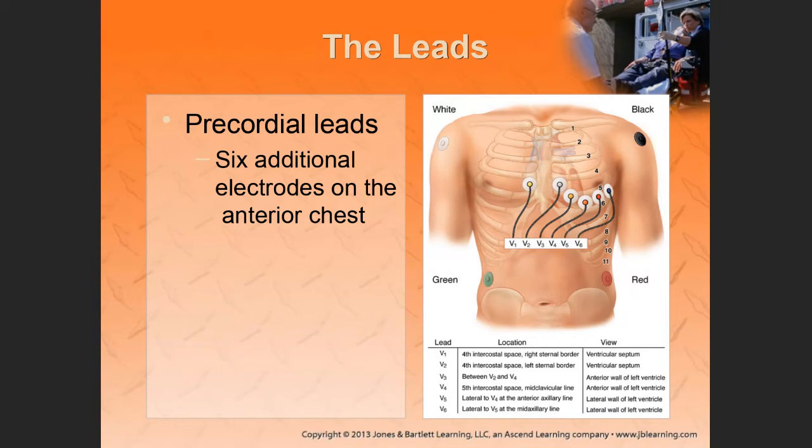Same thing with ECG. You have to know the basics of the waveforms and what they represent, and the difference between cardiac monitoring and doing a 12 lead ECG and what exactly the leads are looking at. So let's recap real quick.